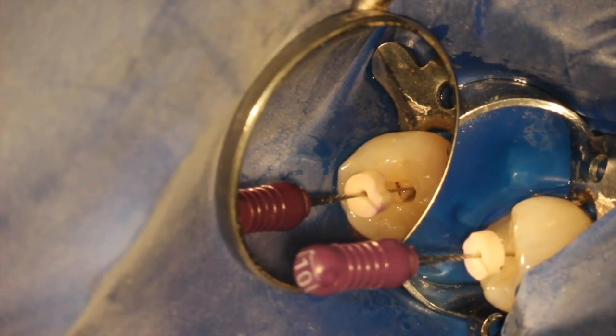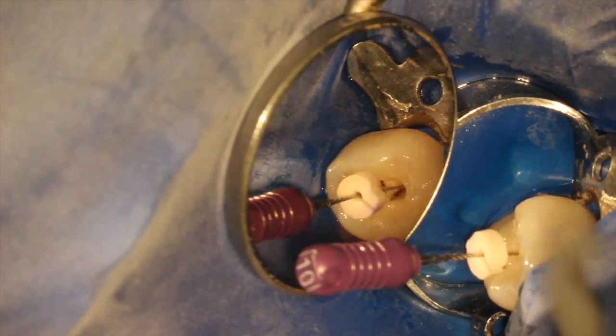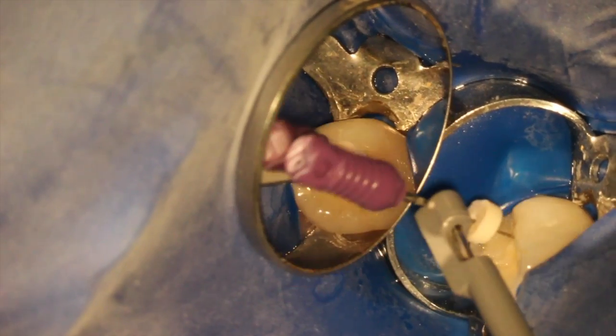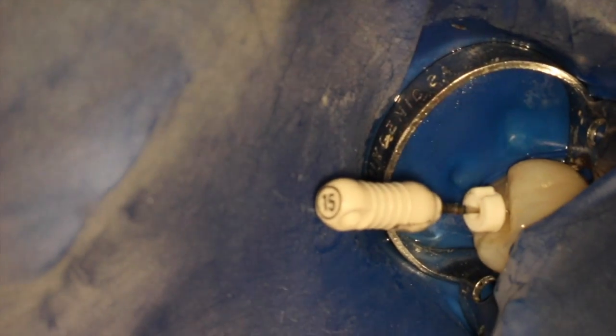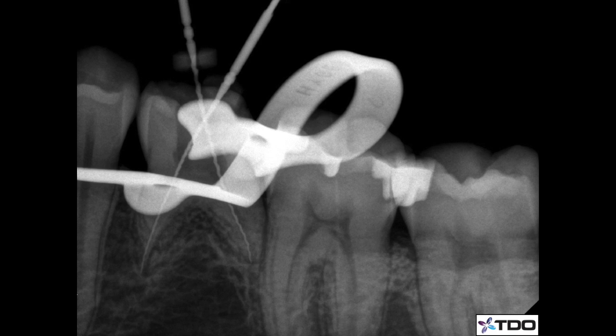We do working length determination. We're careful doing patency filing on primary teeth, especially if there's a tooth bud below. It's really not recommended, but in this case there's no permanent tooth bud sitting below it, so we cleaned and shaped, and used an apex locator for working length determination. I confirmed radiographically because the stoppers are not very stable on these short teeth on the flute parts of the file, so we have to be very careful in confirming the lengths.